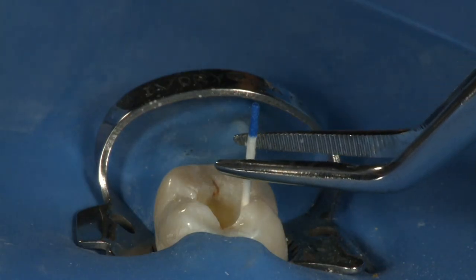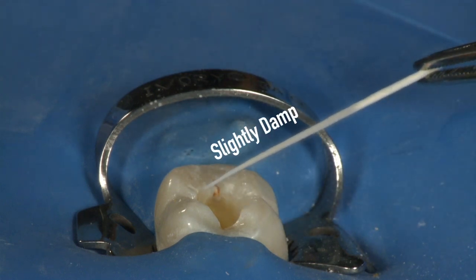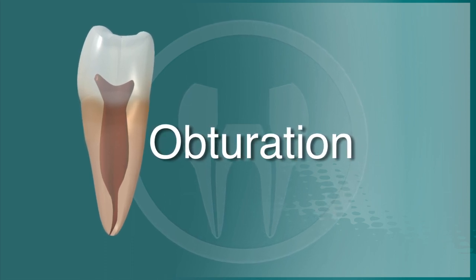Because we will be sealing the canal with EndoRes, it is not necessary to desiccate the canal. Leaving the canal slightly damp will provide the best environment for EndoRes to penetrate into the tubules. We are now ready to move on to the obturation portion of the procedure.